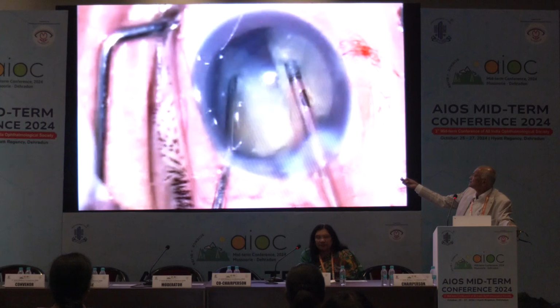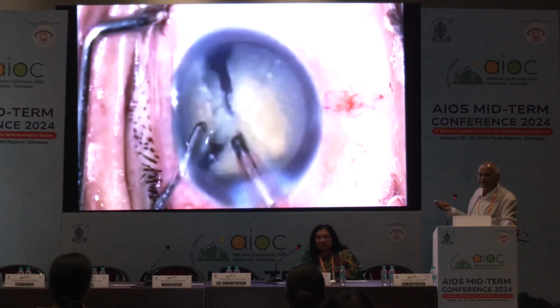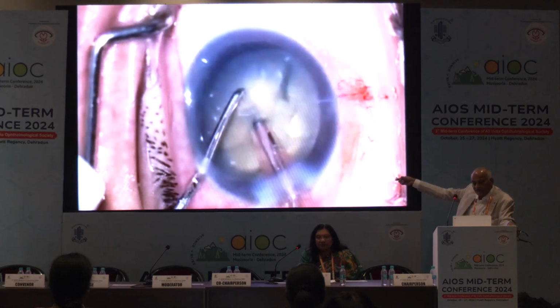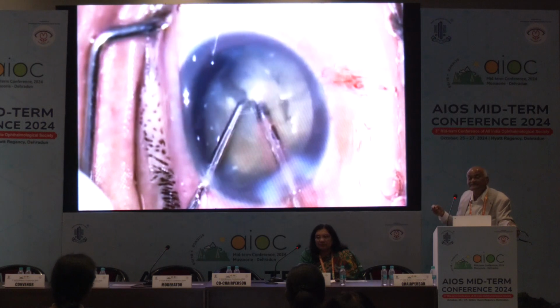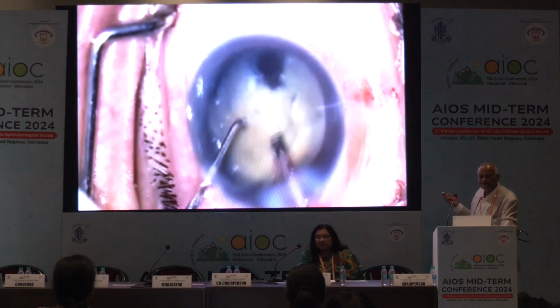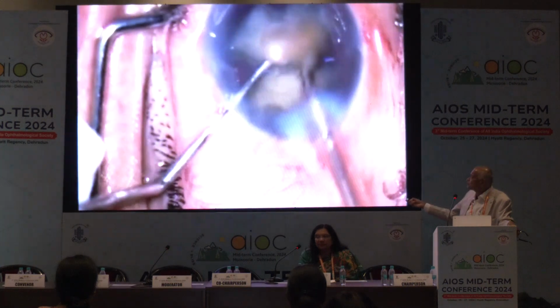and then I made the pieces. Whenever I am making the pieces, you can see my tip is down, it is not up, it is slightly down, so that it goes in the substance of the nucleus. Unless and until it enters the substance of the nucleus, that is not going to make the pieces. See here. So it is not going to make the pieces.